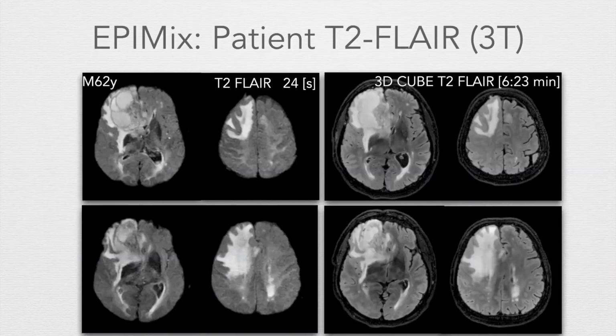And here's a comparison. I showed earlier that we had three papers written now, more or less the same type of paper, where we try to compare diagnostic lesion conspicuity and diagnostic confidence for radiologists just looking at EPIMix data, and then at another location looking at the full conventional brain MRI exam. And here's just an example.